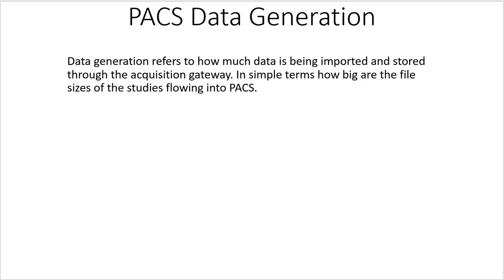And this is different than the acquisition rate, whereas the acquisition rate is concerned with how many studies are coming out of each modality into PACS, and it's the number of studies per modality. Data generation is concerned with the data file size from all the different modalities.